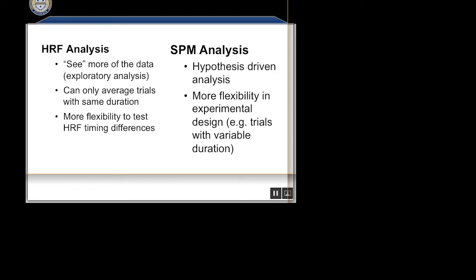But we're going to publish something that says above 10 seconds, which is the vast majority of tasks, it doesn't matter. It's true for both event-related and block design. When you go to event-related, there's a little bit of a caveat with what I said about choosing the window right, but yeah.